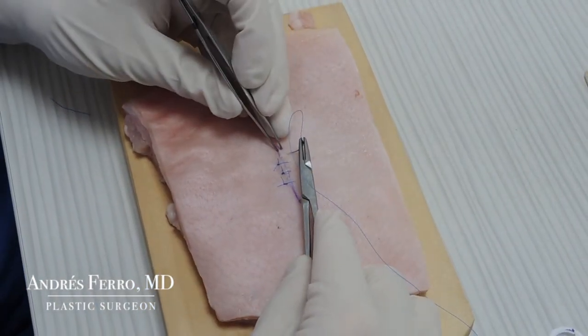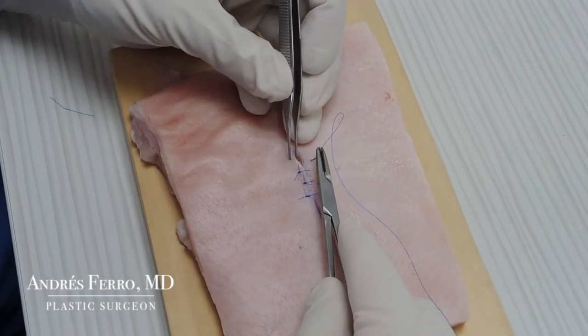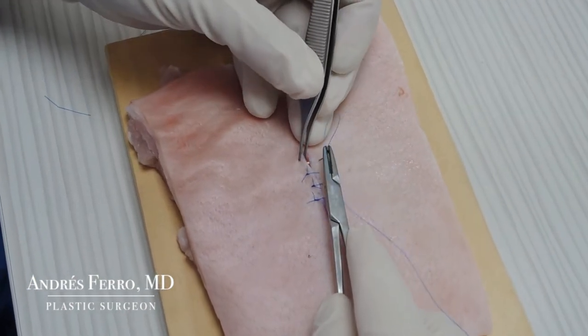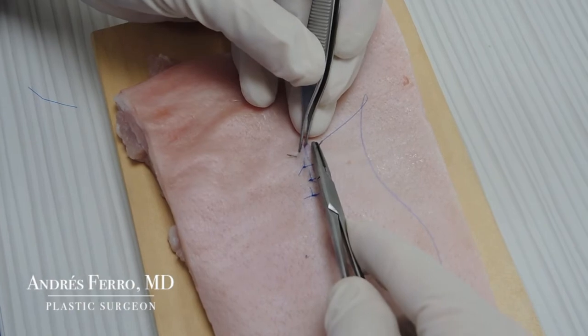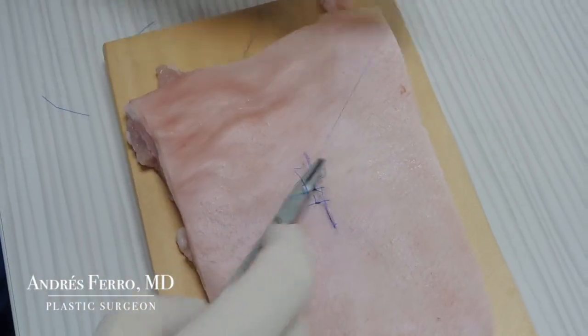Continue closing the wound, doing separate stitches, entering high in the highest edge and elevating the lowest edge in order to find the correct place to insert the needle and level the wound.